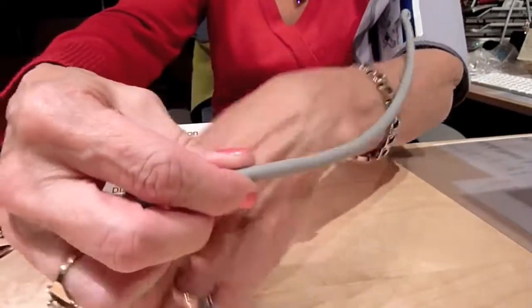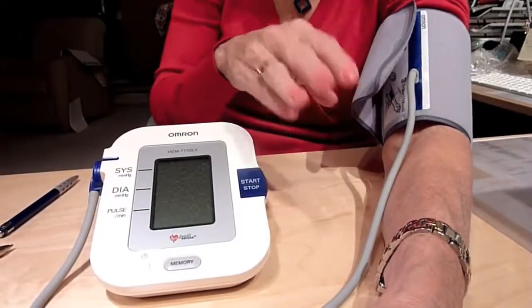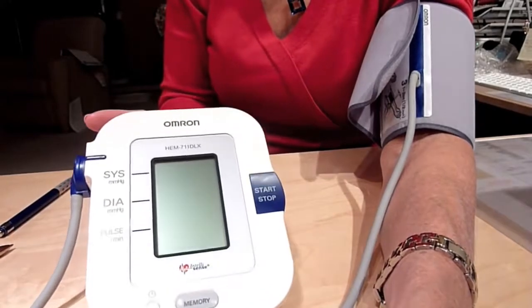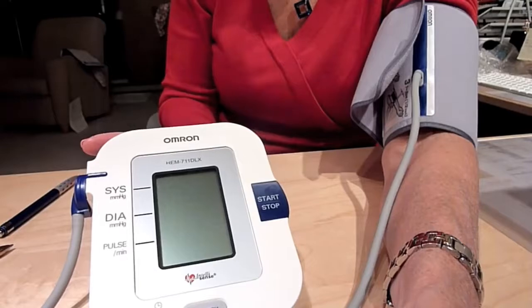Once you're ready to go, make sure the tubing is above your arm, not below it — otherwise it will sense movement. Keep your arm still when you take your blood pressure. Don't move it around or it will stop and start again, and won't get an accurate reading.